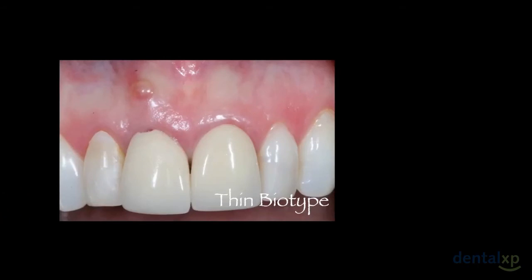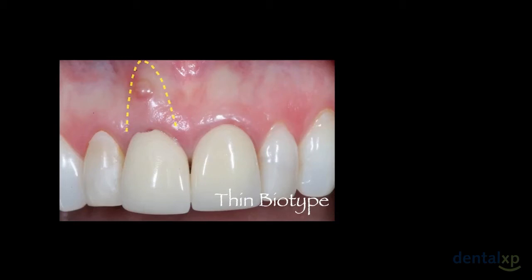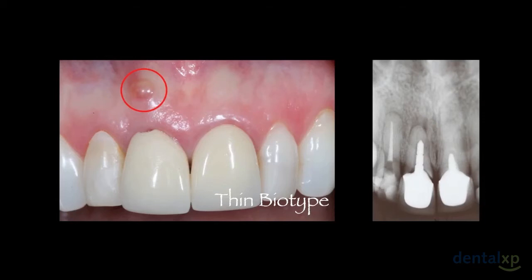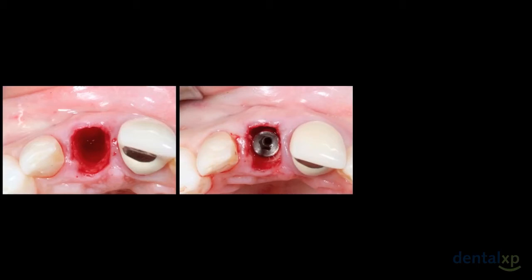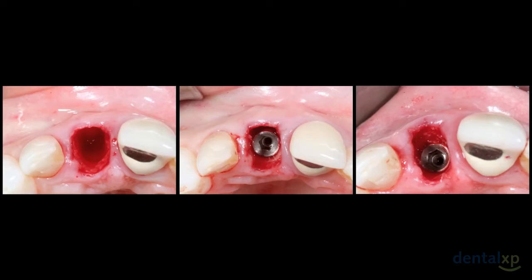This is another case. The right central incisor is compromised and the probing depth was eight millimeters. This is the extent of the bone defect, and we can notice the presence of a fistula. The periapical radiograph evidences good bone volume for primary implant stability. After minimally invasive dental extraction, we could access the defect. After osteotomy with a palatal approach, a platform-switching implant was installed, the corticomedullary graft was inserted, and particulate medullary bone was packed into the gap between the implant and the alveolar socket.